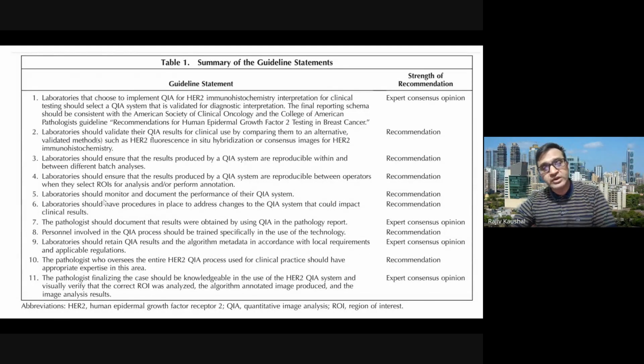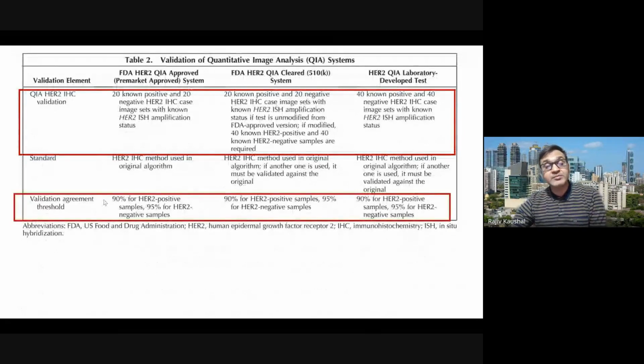I'm not going into the details of all this because these recommendations are mainly for the validations, but what is important is, if you are using any algorithm for testing, and it is an FDA-approved or CE-IVD approved algorithm, then 20 positive and 20 negative cases are sufficient.